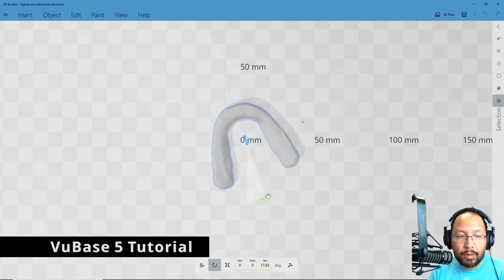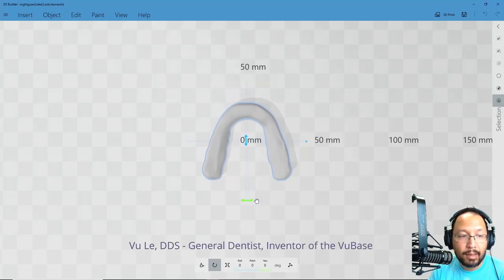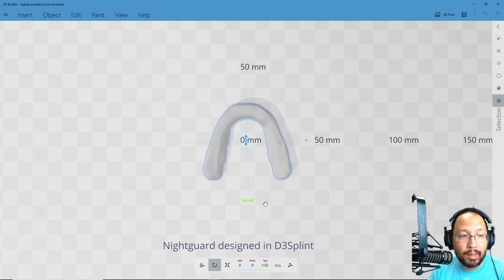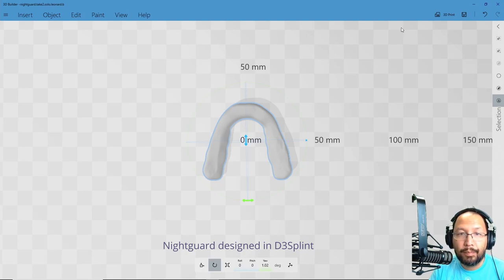I'm going to go ahead and rotate along the yaw axis until the molars look square with the z-axis, or at least get it close, and then I'm going to save the file.